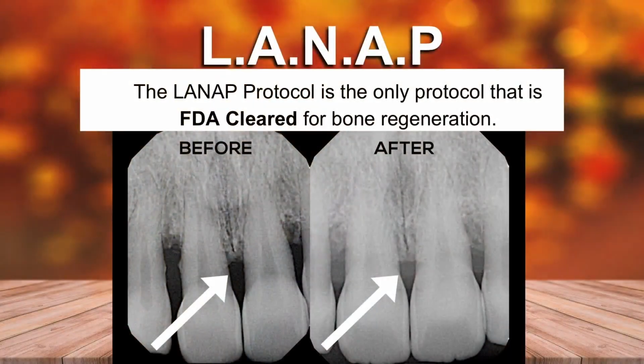And we send them to Dr. Katranji, who then puts those teeth back in. We use the laser, and not all the time, but sometimes, and not infrequently, we get bone regeneration by destroying the bacteria and stopping the infection. I don't cut away the tissue if I can avoid it, because cutting away the tissue leaves those teeth sensitive. It leaves spaces between the teeth. The patients are really unhappy. You know, they don't want to go through that. And they don't need to go through that if we can stop the infection.